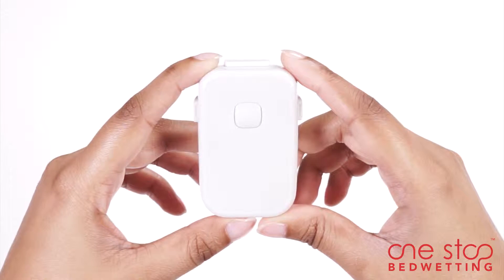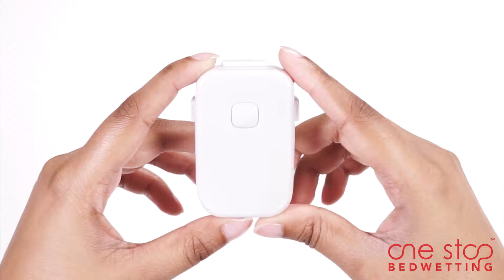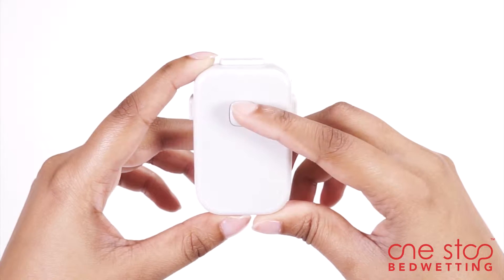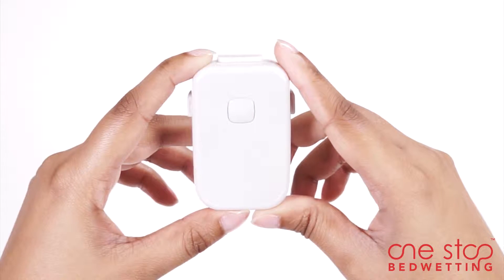Guardian Bedside Alarm can be easily programmed by pressing the program switch. The switch helps you choose from sound and vibration, sound only, and vibration only settings. Once you have made the selection, Guardian is ready for use.